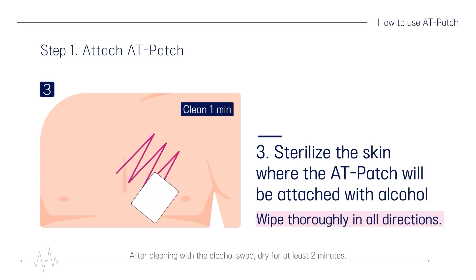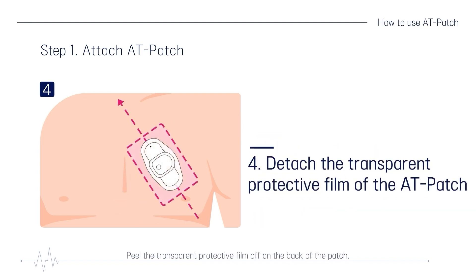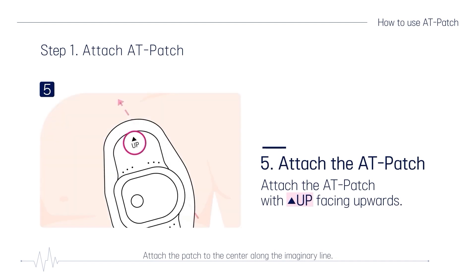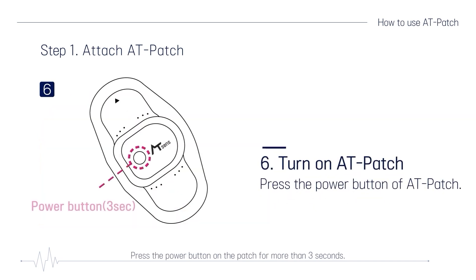After cleaning with the alcohol swab, dry for at least two minutes. Peel the transparent protective film off the back of the patch. Attach the patch to the center along the imaginary line. It must be attached with the up marking direction facing upwards. Press the power button on the patch for more than three seconds.